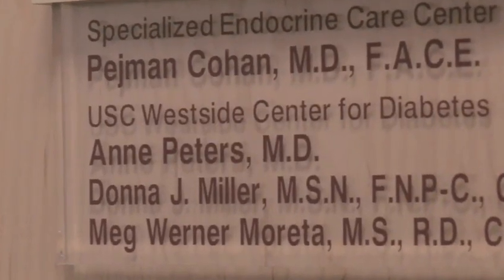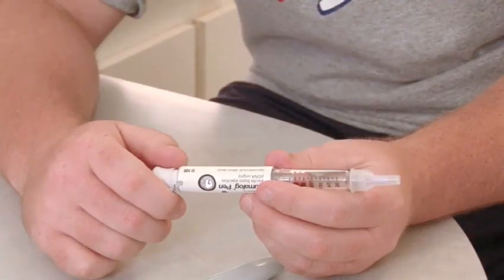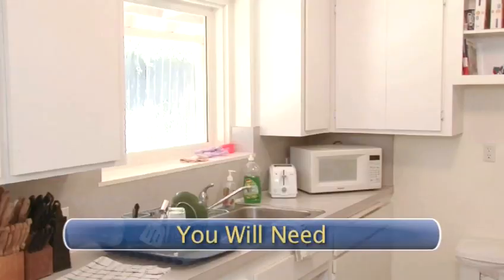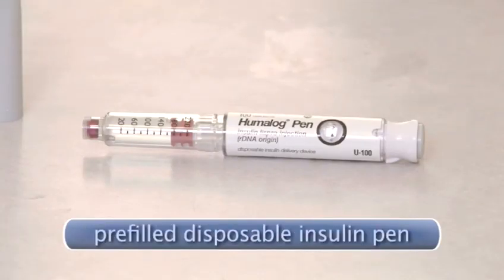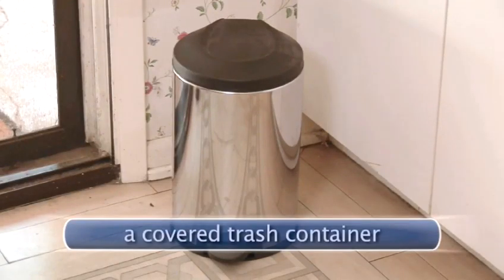Even though you must review the proper way to use your prescribed insulin pen with a doctor, this refresher will give you a good idea of how to use a pre-filled disposable insulin pen. You will need a sink to wash and dry your hands, two alcohol swabs, a pre-filled disposable insulin pen, fresh needles, and a covered trash container.